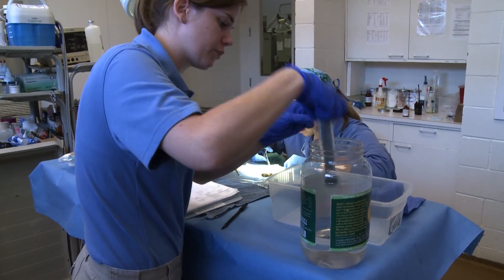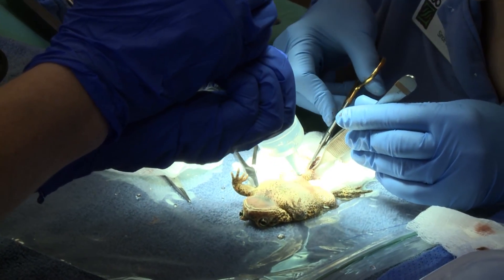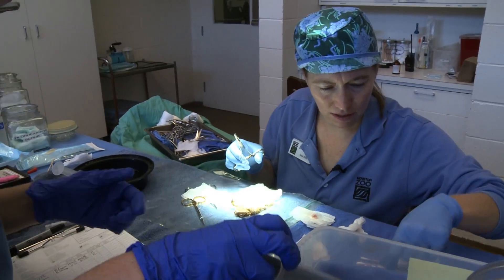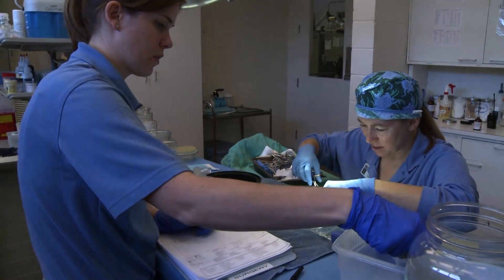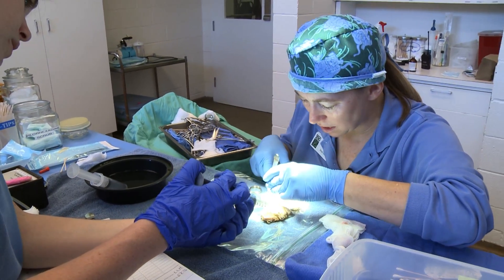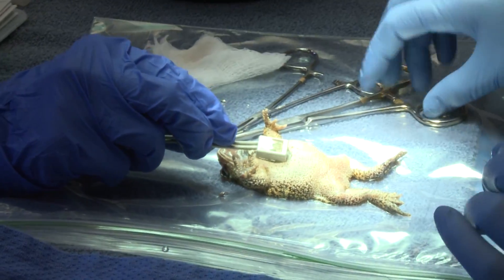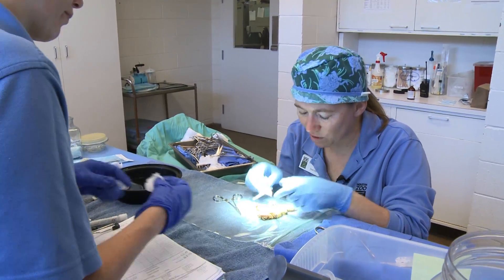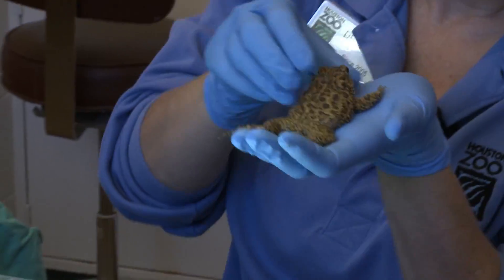Can you rinse him with regular water again, Eva? I think we're almost done, so we can start telling him he should wake up. Before he's fully awake we'll lay him flat out and get a really good post-op radiograph so we can see what the toes look like on the inside. Let's rinse him again a couple of times and then take x-rays. Before we take him over, put the Doppler on him for a minute so we can hear his heartbeat. The x-ray unit is all set — we'll take him in for a quick post-operative radiograph and then bring him back here to wake up. There's a little bit of breathing or swallowing — welcome back.